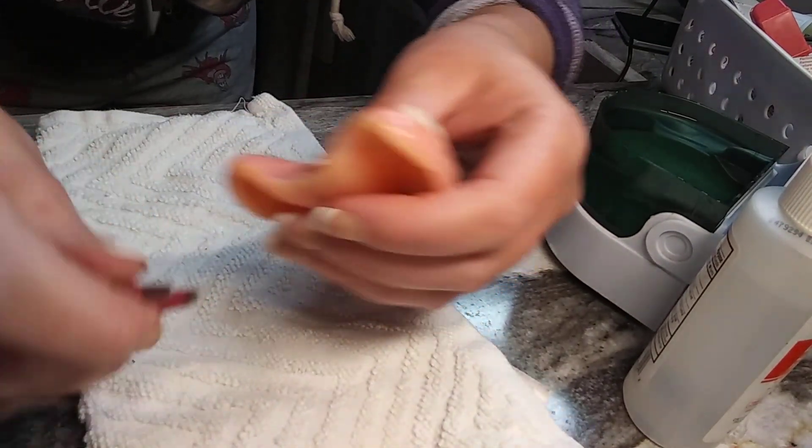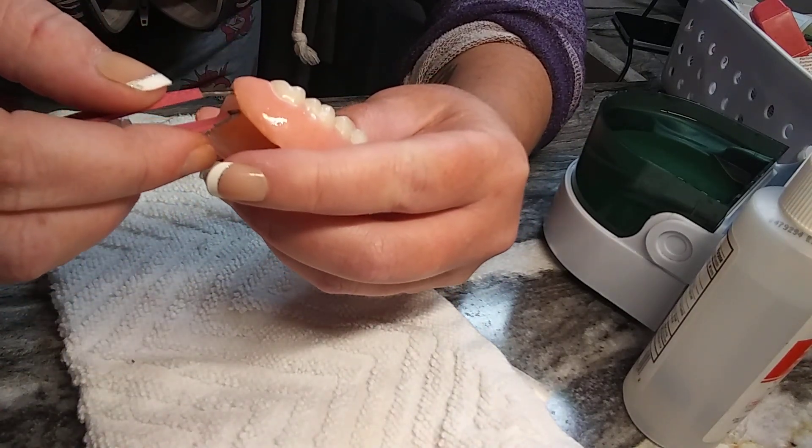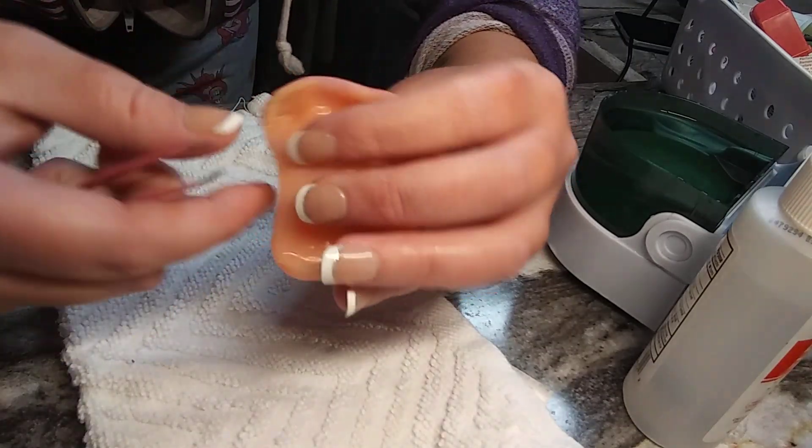Normally people say oh it comes right out — they lie. It does not easily just pop out unless you're using cushion grip, which is not even a soft reliner. No reline comes out easily unless it wasn't done properly. If it comes out easily, that means bacteria is all up in there — every liquid's getting in there. If it was that easy to break through, it should have been replaced a long time ago or it was never done properly.